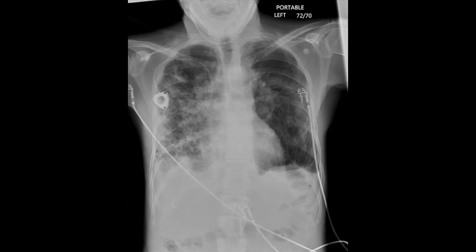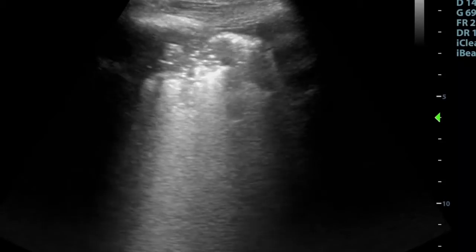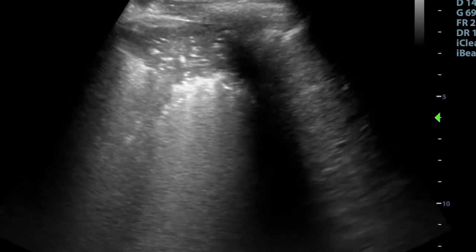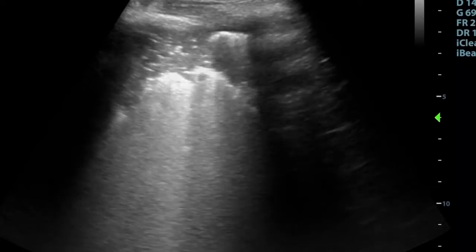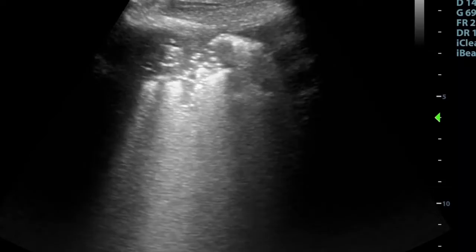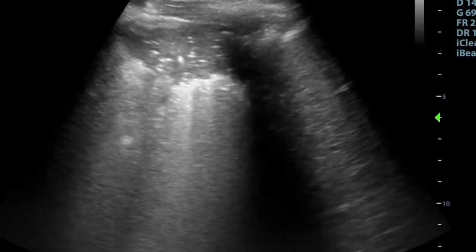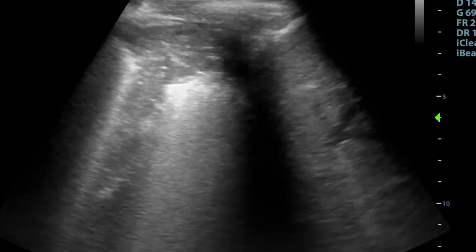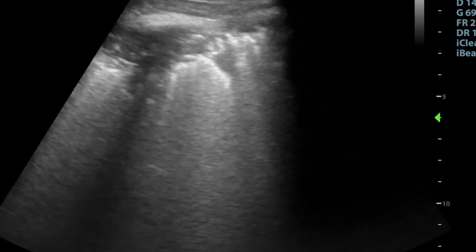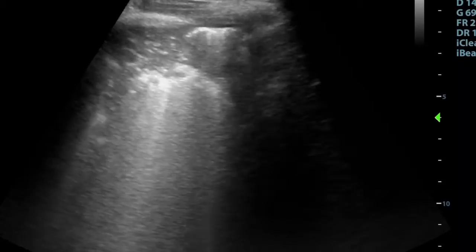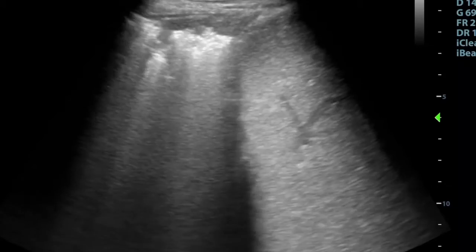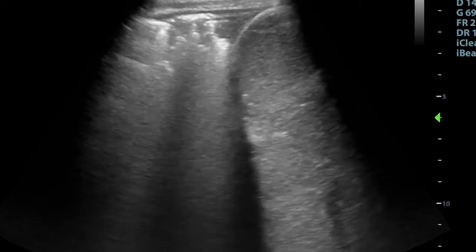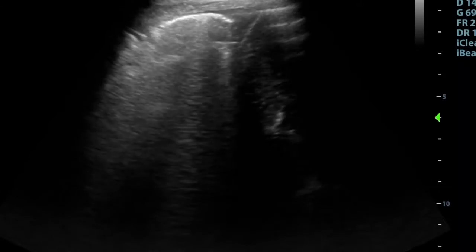He laid down the ultrasound probe. He obtained anterior and lateral views of the right lower lung fields using the abdominal probe, orienting it longitudinally. He's able to get these great clips fanning through the lung field just above the diaphragm and liver, which you can see on the right of the screen.